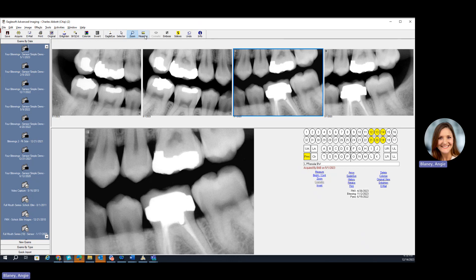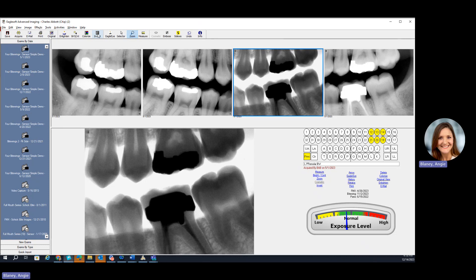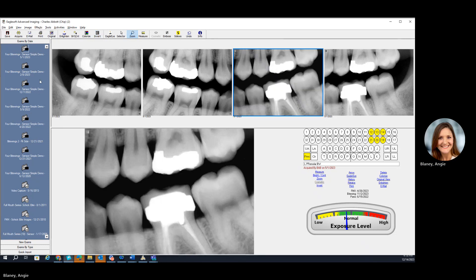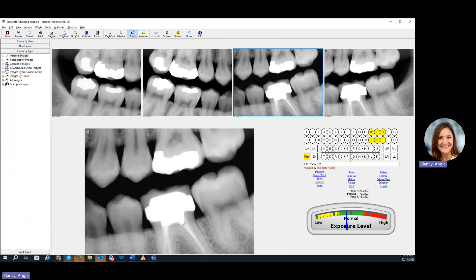You also have the ability to do some measuring. There's also some colorizing that can be done as well, just to make things really fancy. The imaging module is going to list all your exams on the left-hand side, starting with the most recent at the top. You can also look at exams by type, so if you did want to isolate those by type, you could do that as well.